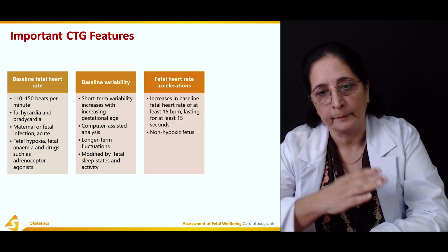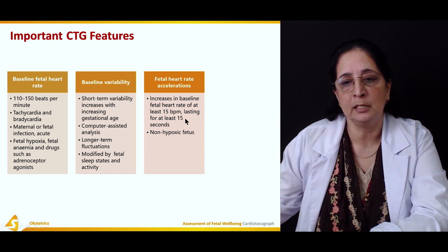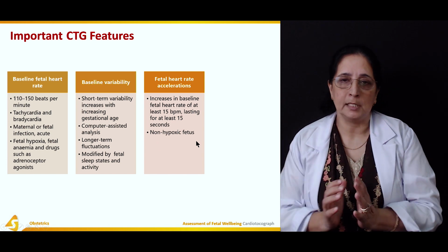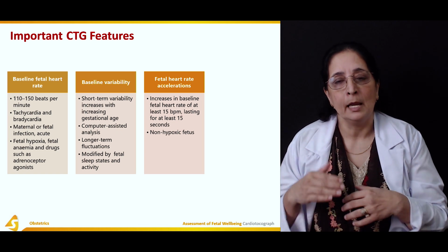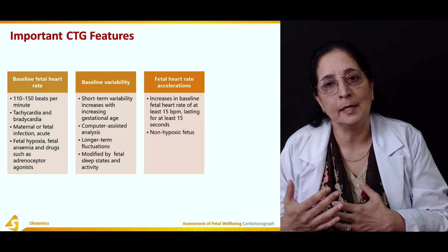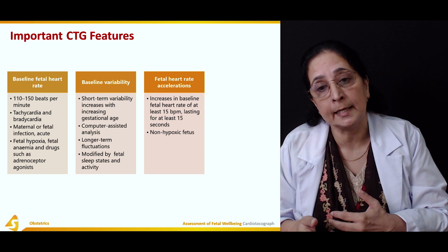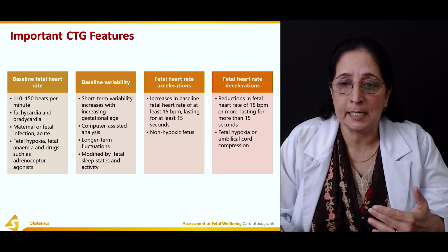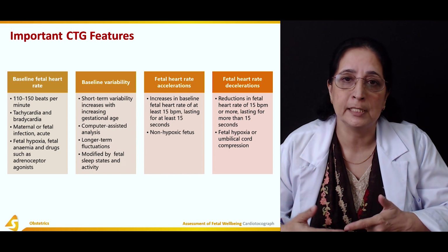Accelerations are an increase in baseline fetal heart rate of 15 beats per minute, lasting for at least 15 seconds, in a non-hypoxic fetus. No hypoxia is present, no decreased supply of oxygen is present, but even with that, there is acceleration of 15 beats per minute for 15 seconds. That's the acceleration.